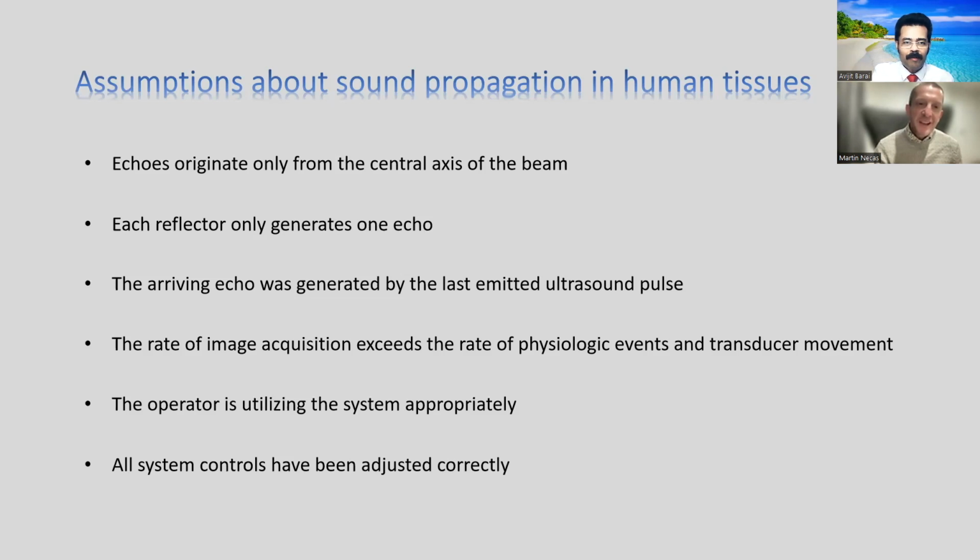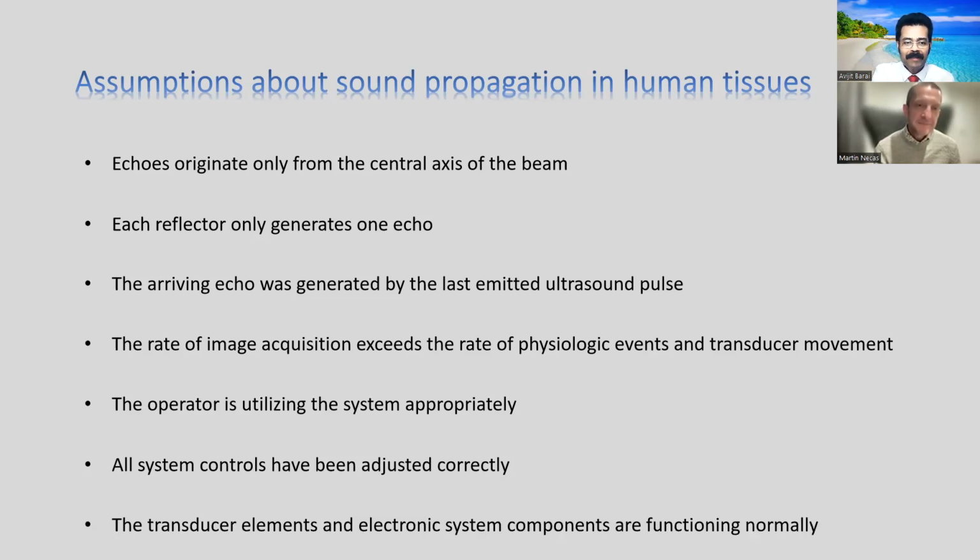So it's almost like an illusion or hallucination, you can say, that there is something not there, but we can see it, or the machine can probably think that something is there, but actually it is not. That is absolutely the artifact. Yeah. Absolutely. And in other ways, you could say that the machine, as sophisticated as it is, is a dumb instrument. It cannot distinguish whether an echo is real or not. It's really up to us if we are responsible.